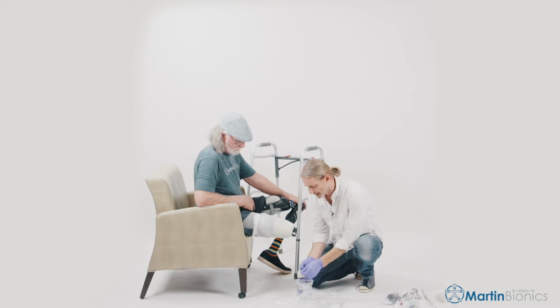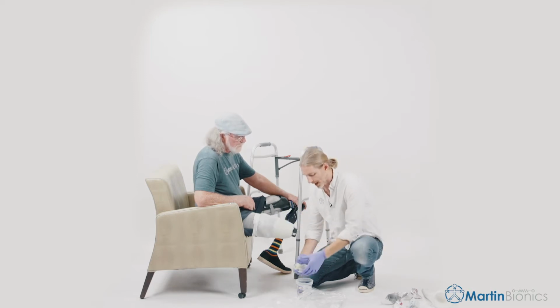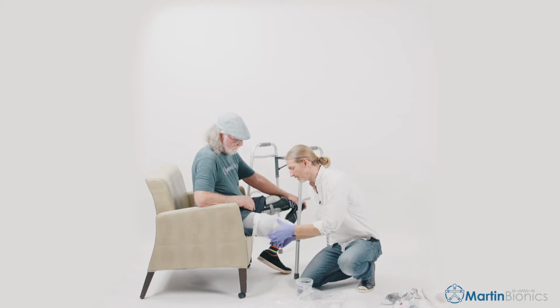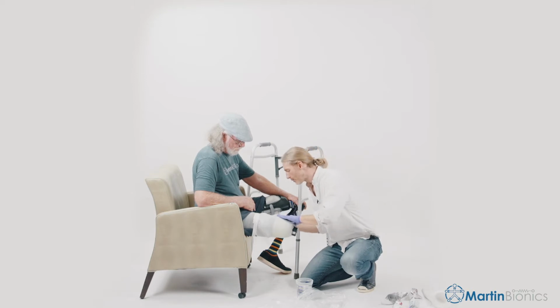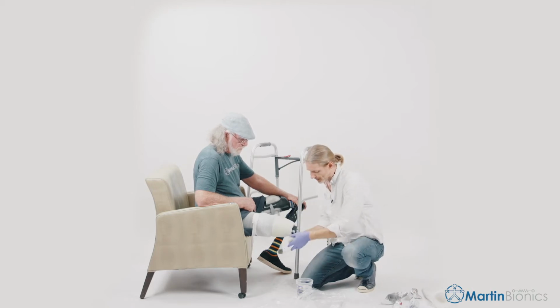So when we do the next step, we'll make the frame section a little bit lower, so we have a little bit of a flexible inner socket transition point at the top edge. That's why I like to use the 3M soft cast. Make this a nice, smooth proximal end, so we won't even really have to trim this off at all. Just come right to that same proximal end. Going to wrap this in.